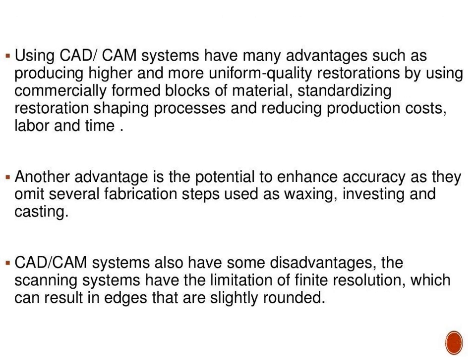Using CAD/CAM systems has many advantages such as producing higher and more uniform quality restorations by using commercially formed blocks of material, standardizing restoration shaping processes, and reducing production cost, labor, as well as time. Another advantage is the potential to enhance accuracy as they omit several fabrication steps used for waxing, investing, and casting. CAD/CAM systems also have some disadvantages.